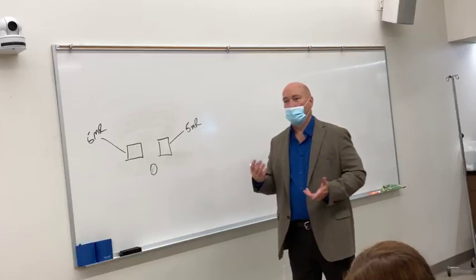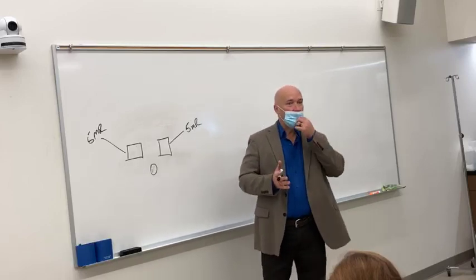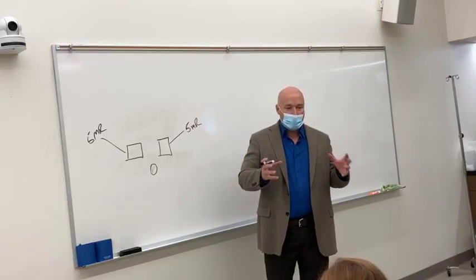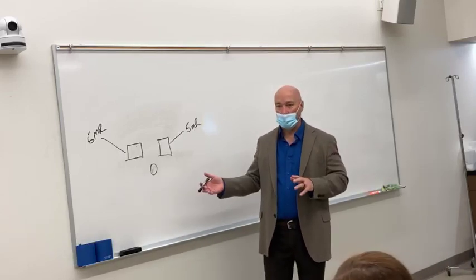So now let's say we've got a patient, and we're doing a chest X-ray as the next patient, and your first patient was hyposthenic, so thin. Your next patient is hypersthenic, okay? Your machine doesn't have any kind of a setting for different patient sizes, but you've gone from a hyposthenic patient to a hypersthenic patient.